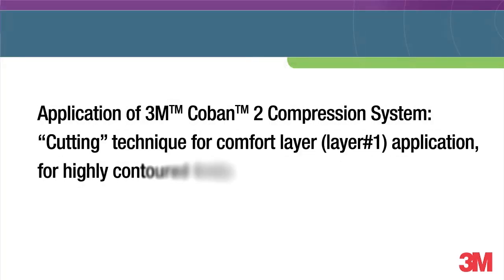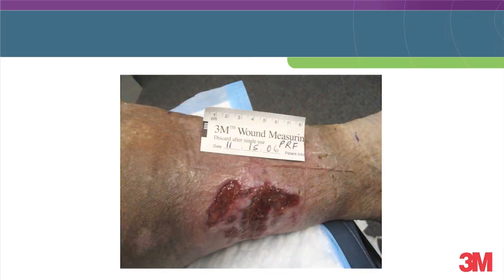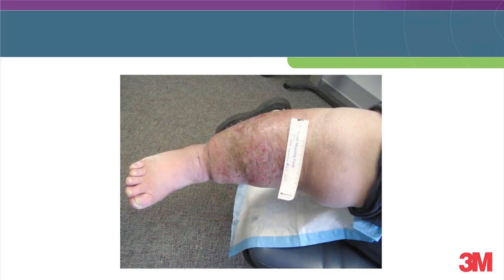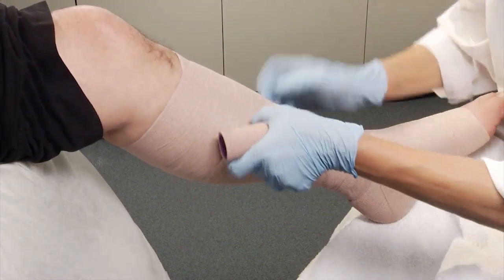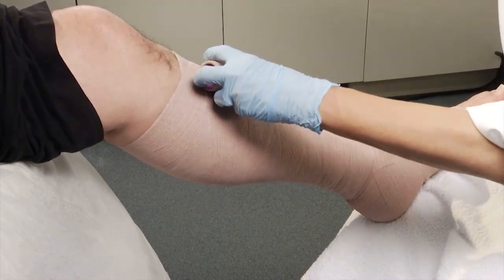Welcome to our demonstration of the application of 3M Coban 2 compression systems that shows the cutting technique. Many patients with lower extremity oedema and venous ulcers have extreme contours where applying a simple spiral bandage may be challenging. Because of the unique cohesive properties, 3M Coban 2 compression systems can be adapted to fit a variety of contours using a cutting technique or a follow-the-roll technique. The goal is to create an anatomical fit around the patient's limb that results in a firm inelastic sleeve that provides the ideal resistance to the muscle dynamics within the bandage.